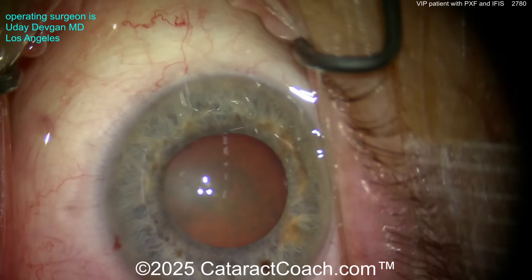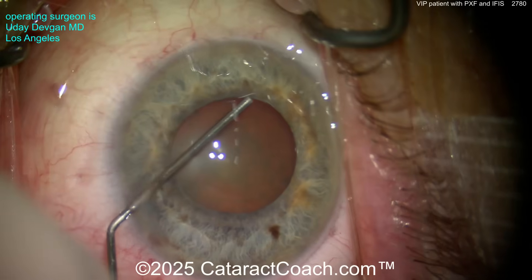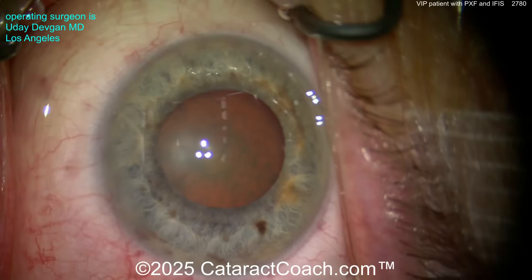Starting off, this is the maximum pharmacologic dilation — that's it. 10% phenylephrine applied many times, and that's all I got. Here I'm putting in some anesthetic inside the eye: phenylephrine as well as preservative-free lidocaine intracamerally, and that helps give me a little more dilation.